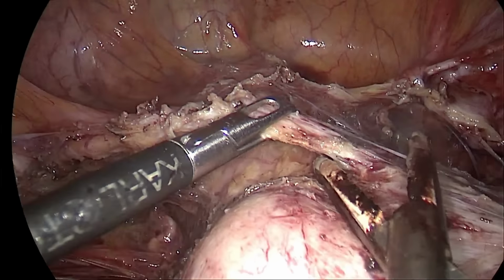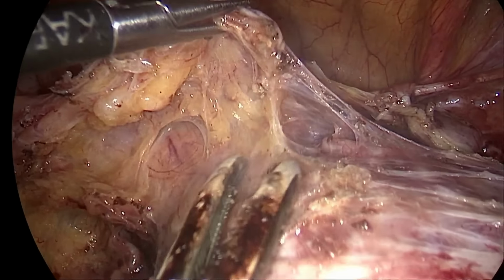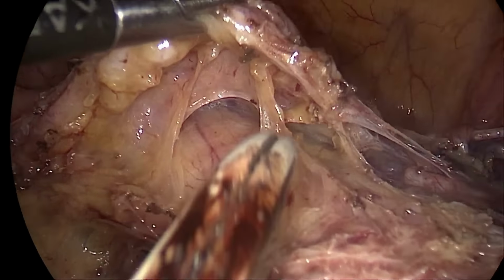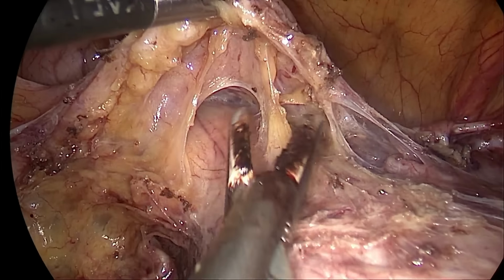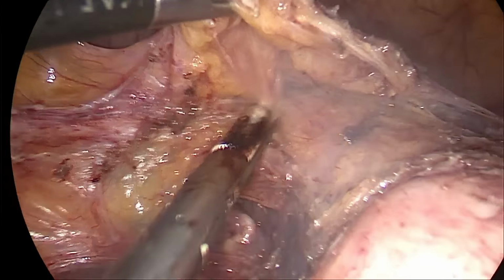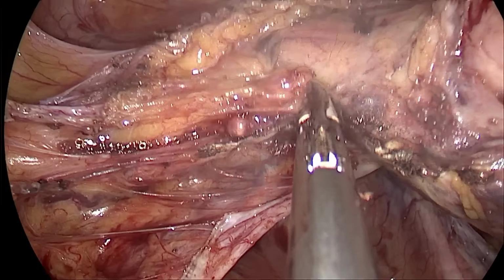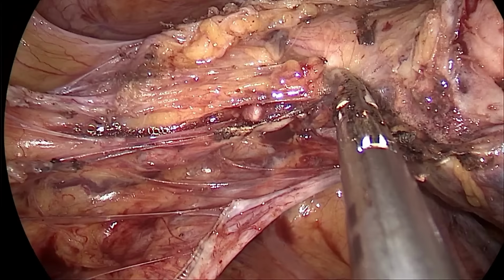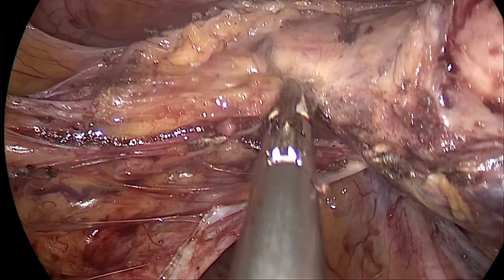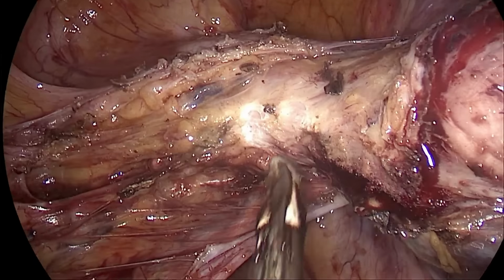Now we have got a good plane. So traction and counter traction is very much important in laparoscopy. Yes, that's a very good plane. So till now we have not used any manipulator in this case. That's our uterine pedicle, duly coagulated.